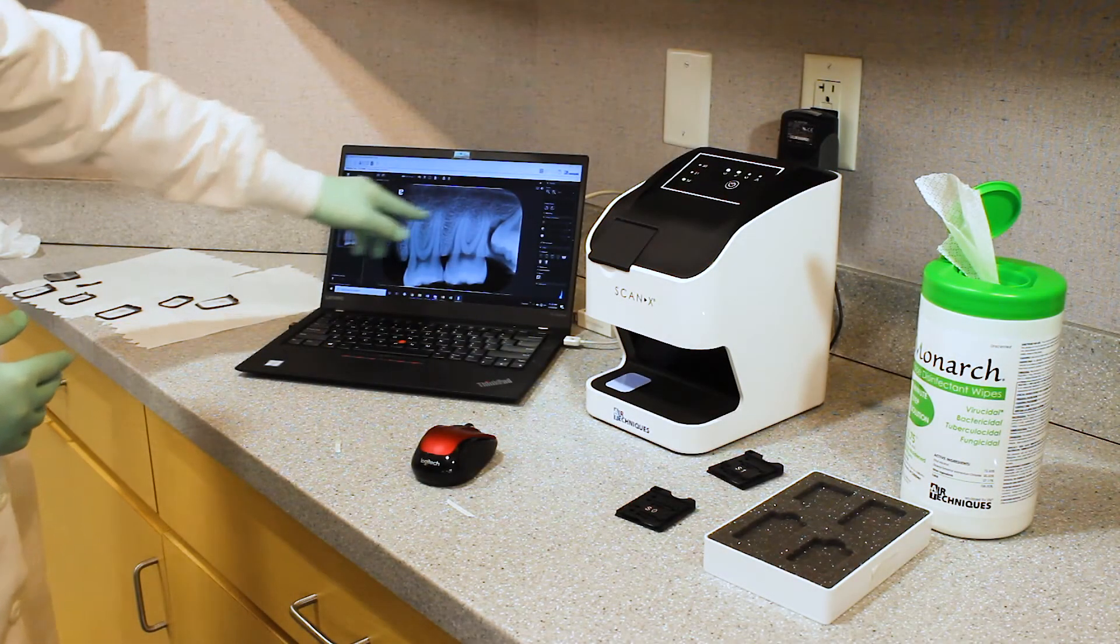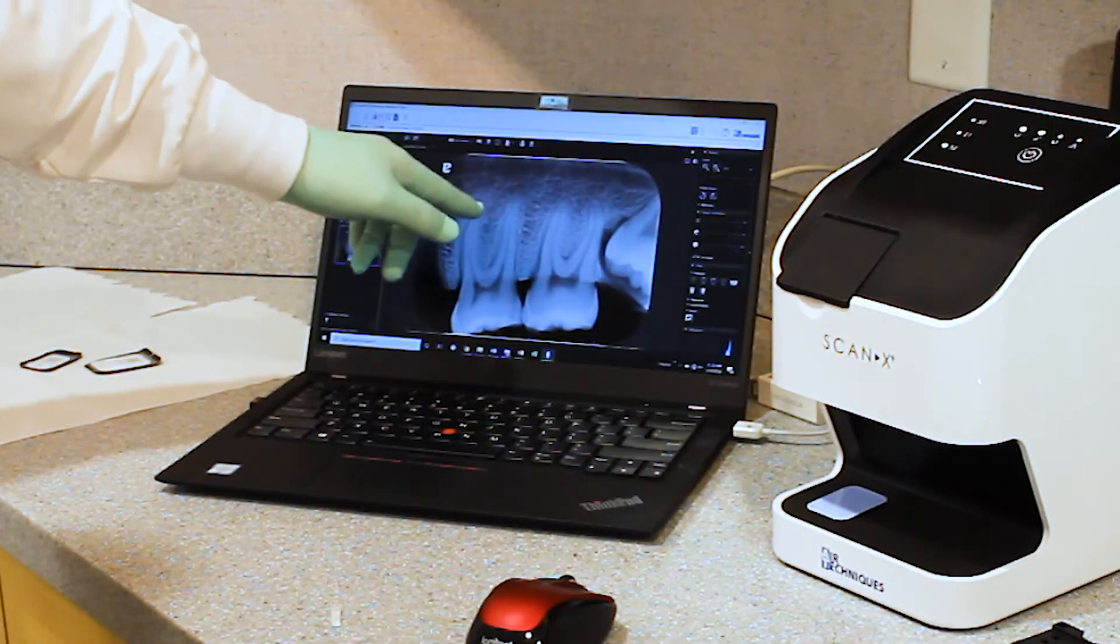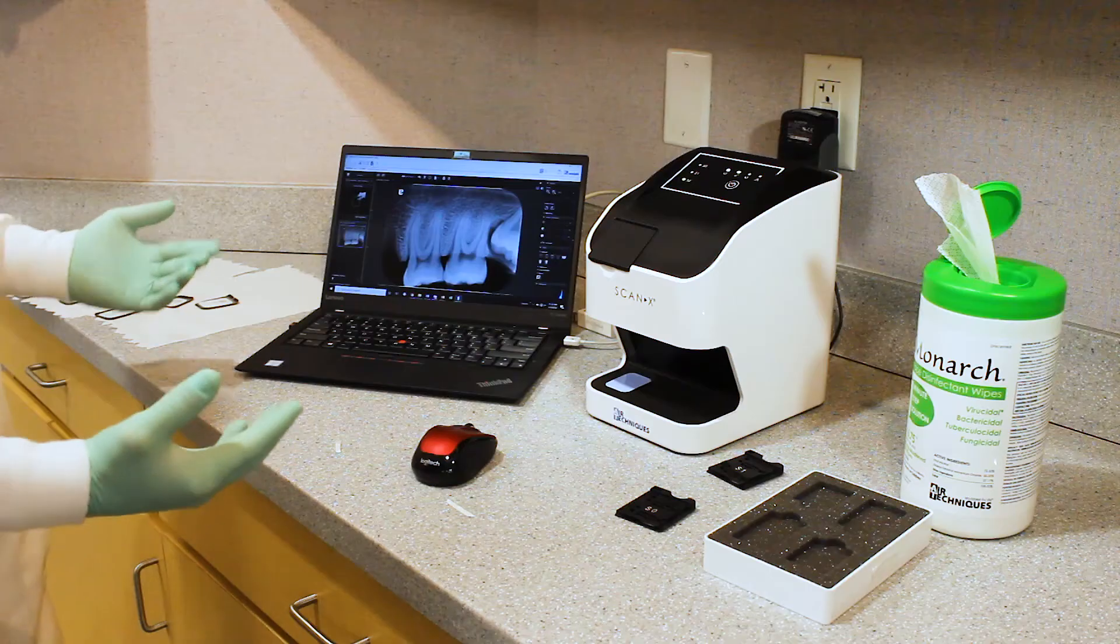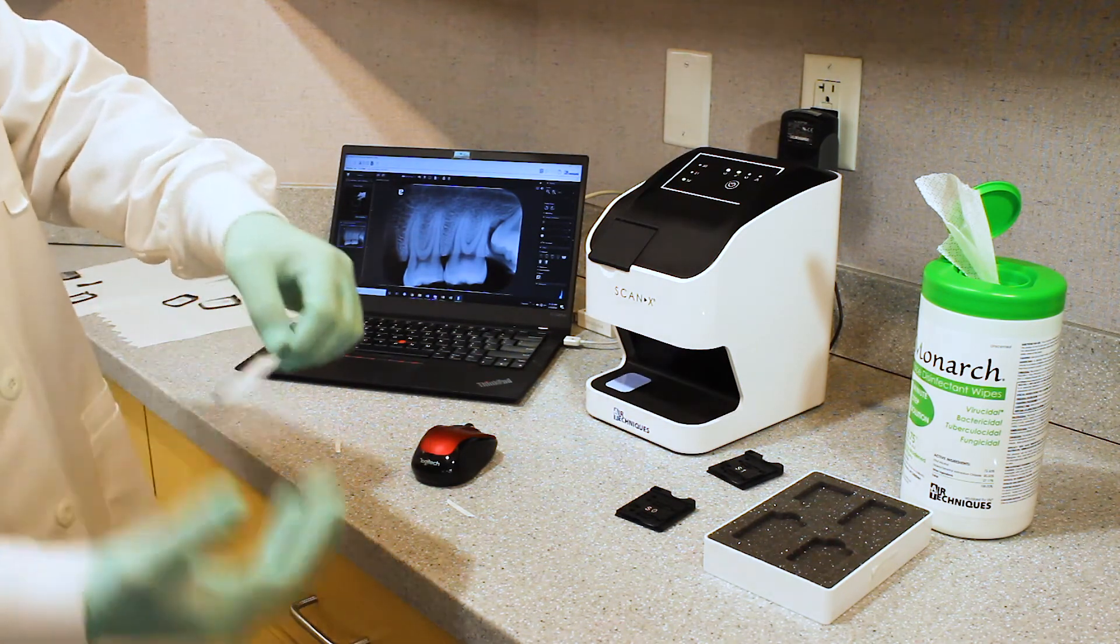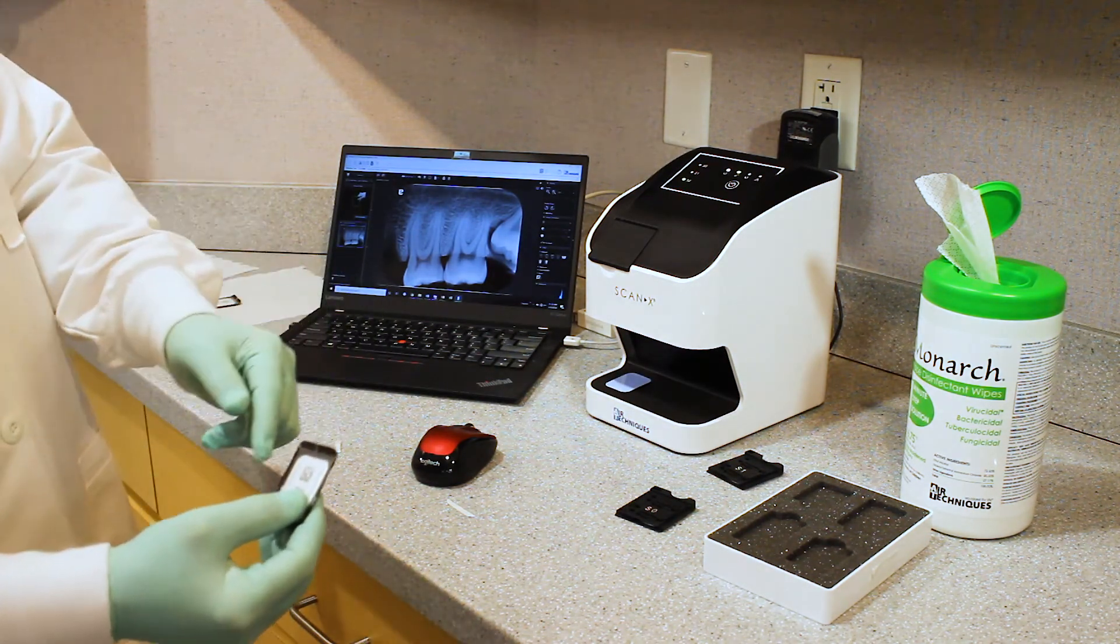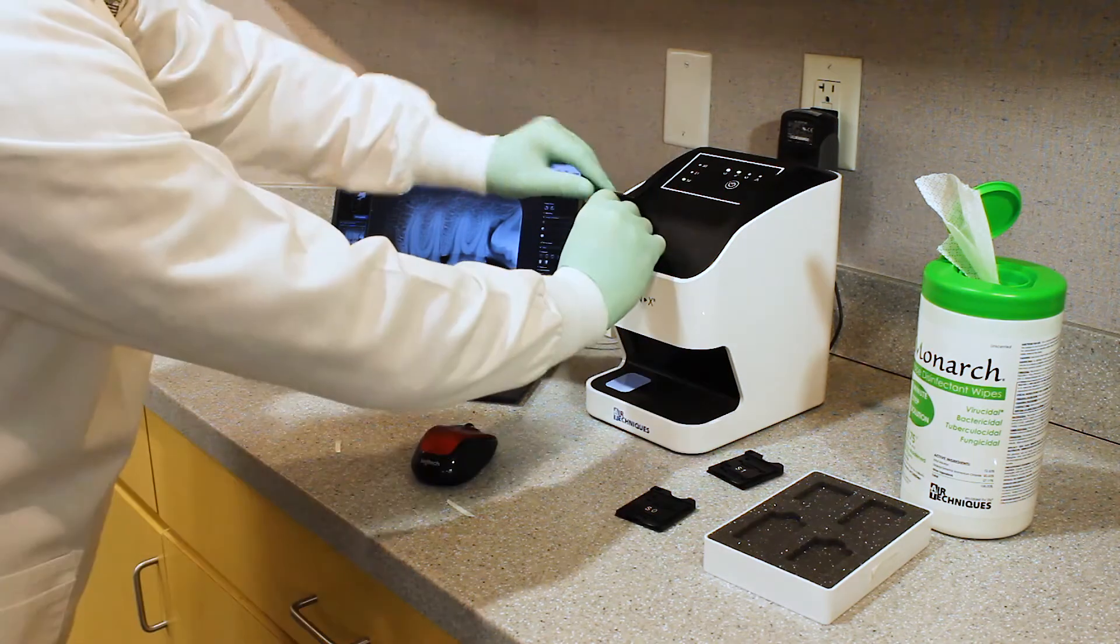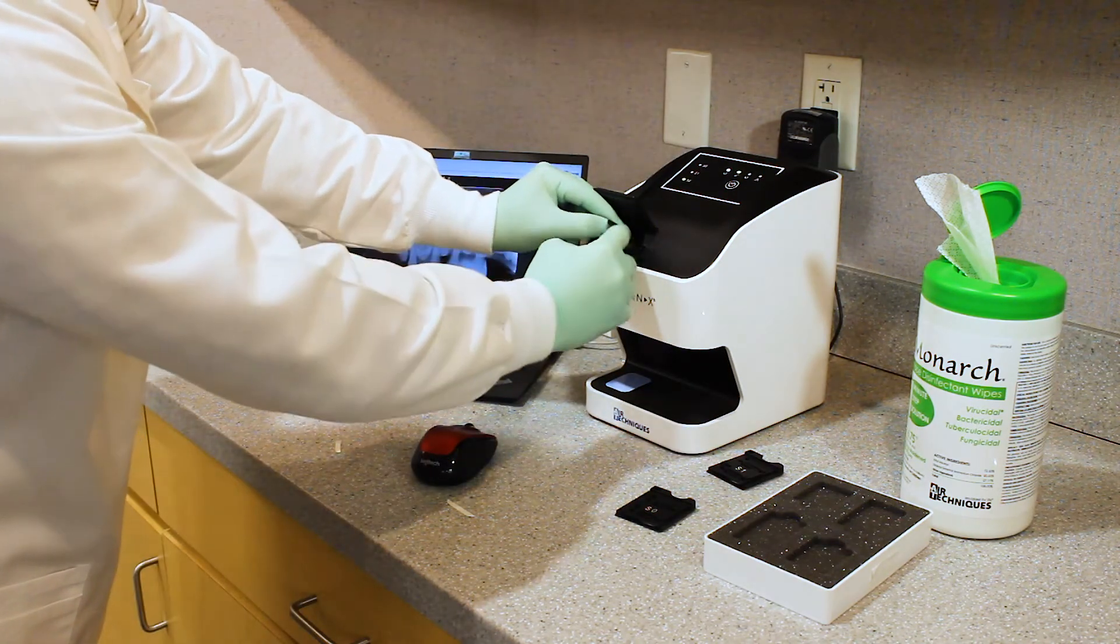So as you see, our image appeared within our VisionX software and we can insert another size two. Again, my exposed PSP in the disinfectant barrier envelope. We will insert it into the cartridge like so.